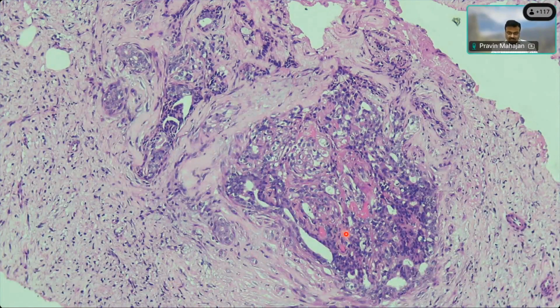So here again it can't be a DCIS because you don't see nice punched out areas. The cells are of very different sizes. There is some crowding of the cells here, and less crowding there. Some sclerosis. Usually in DCIS of low nuclear grade, you have very monomorphic cells filling the ducts, and you will have very regular punched out areas. So that helps to make the diagnosis of DCIS. This certainly is not a high grade DCIS, because high grade DCIS will have larger cells with high NC ratio and nucleoli. So this does look like some sclerosed lesion within the duct, maybe a papilloma.